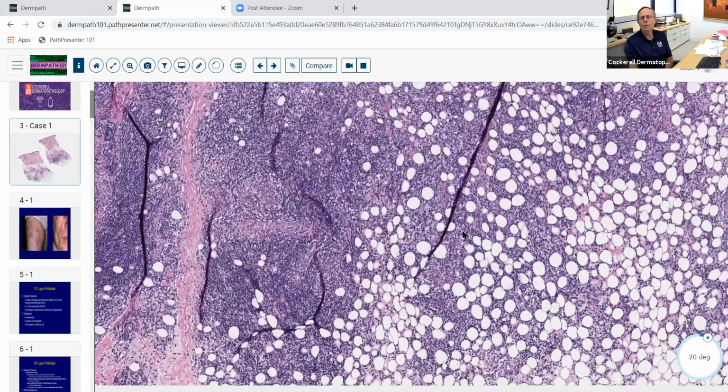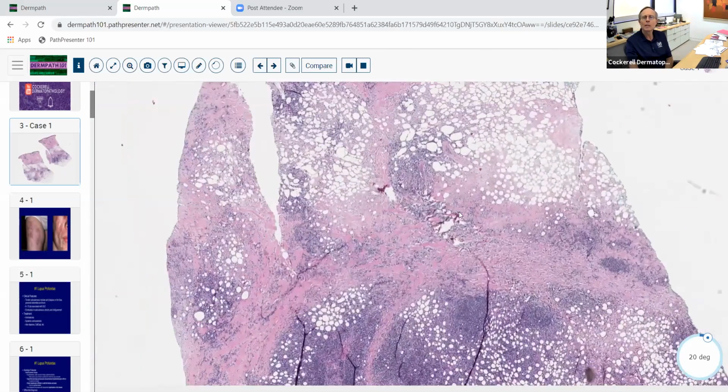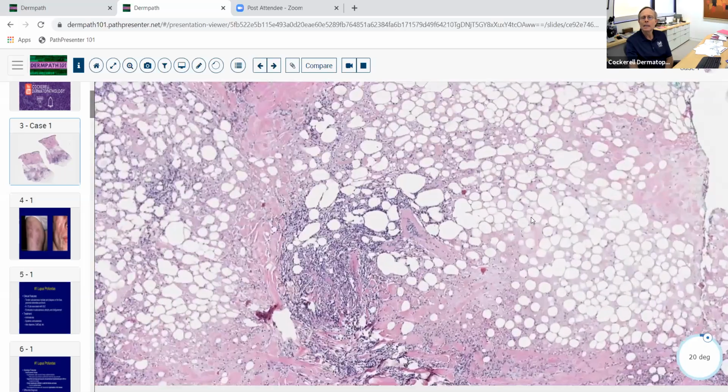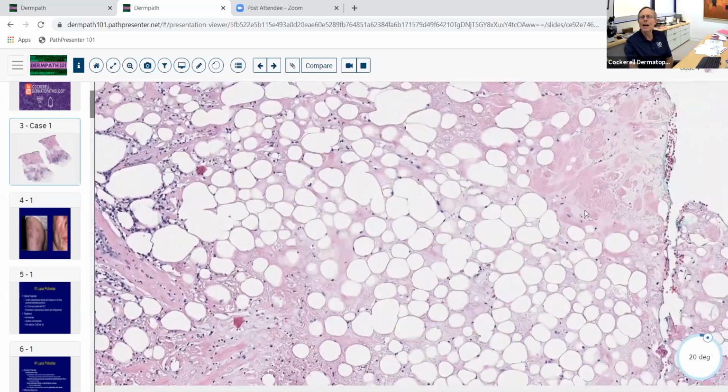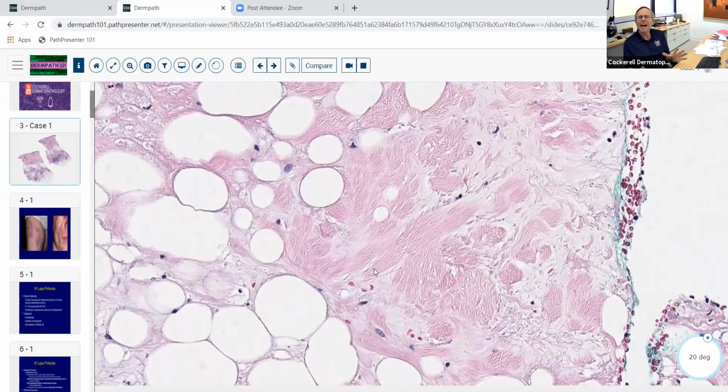The number one thing I would really want you to think about here would be lupus erythematosus profundus, LE panniculitis. And here you see that mummified fat that's just turned to this hyaline-like material. And you can imagine if you were to palpate somebody's skin where their fat had turned to this pink, firm, fibrotic, mummified material, it's going to feel like a block of wood.